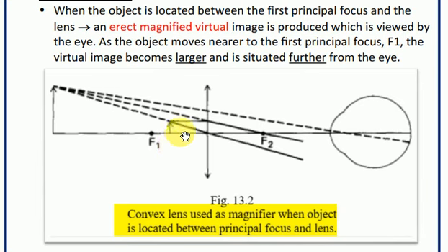So this handheld magnifier can be positioned by the user so that the image is formed at a comfortable viewing distance from the eye. The stand magnifiers are made so that the optimum object lens distance is maintained.